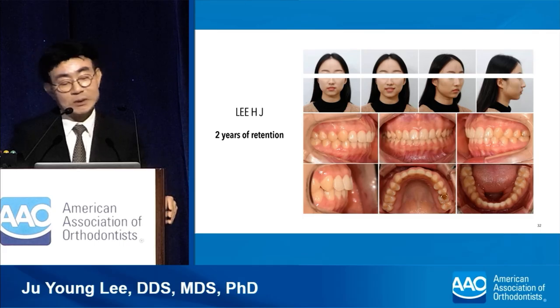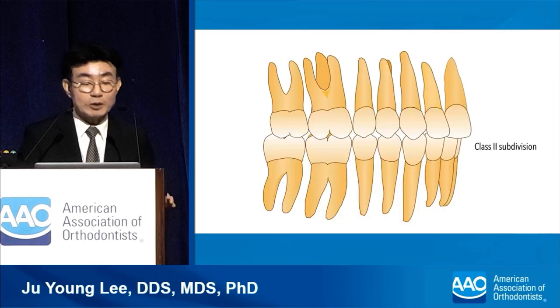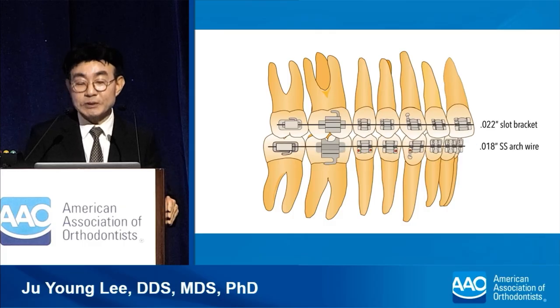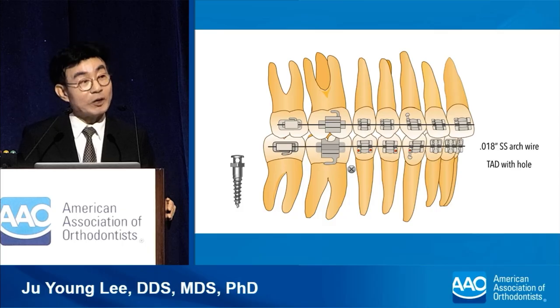In many cases, protraction is more useful than retraction in the treatment of class 2 malocclusion. Let's take a closer look at the lead spring mechanics in a class 2 subdivision example. Due to the nature of class 2 occlusion, its overjet increases after leveling. First, the TAD with the hole type head is installed in the posterior area of the mandible. During the installation, the direction of the hole is adjusted horizontally so that the wire can be inserted into the TAD like a molar tube.